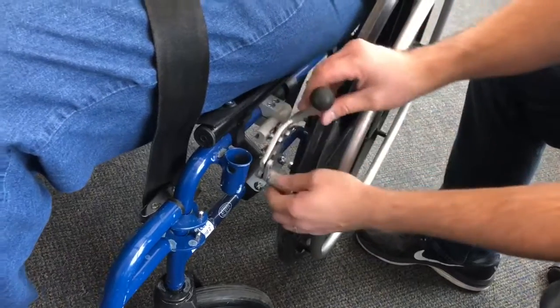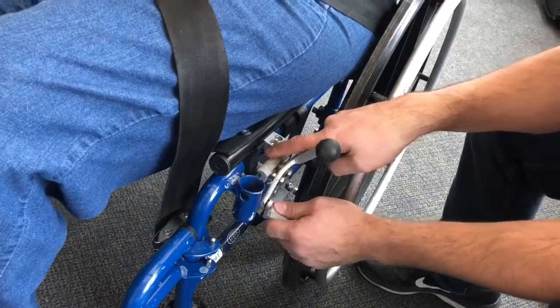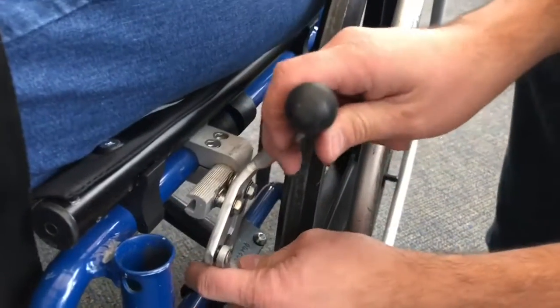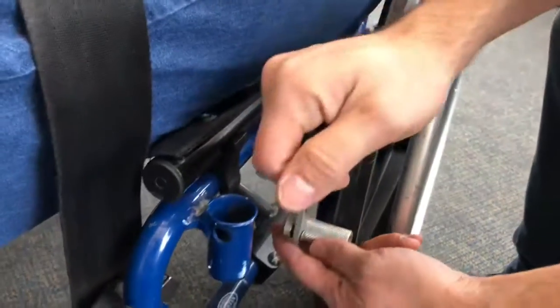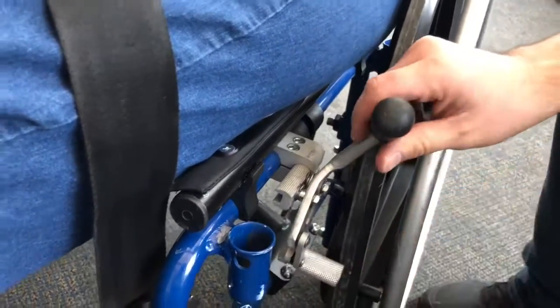So now I'm just going to take this, and we have two things we could do. We could either take this whole part right here and try to move it forward, but you see they have bump stops right here. So we're only going to be able to move it to right there. But actually that seems like it locks decently. But I think I might want it just a little bit tighter than it's able to give.